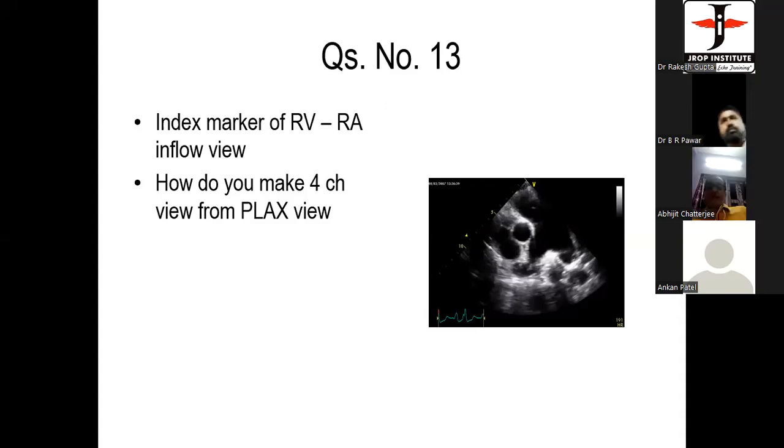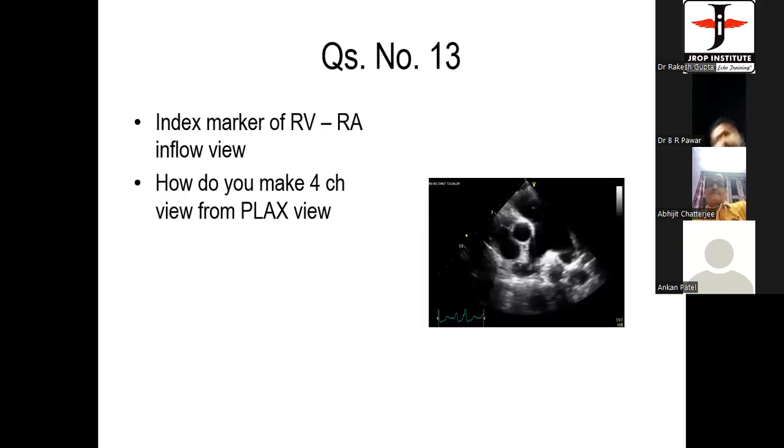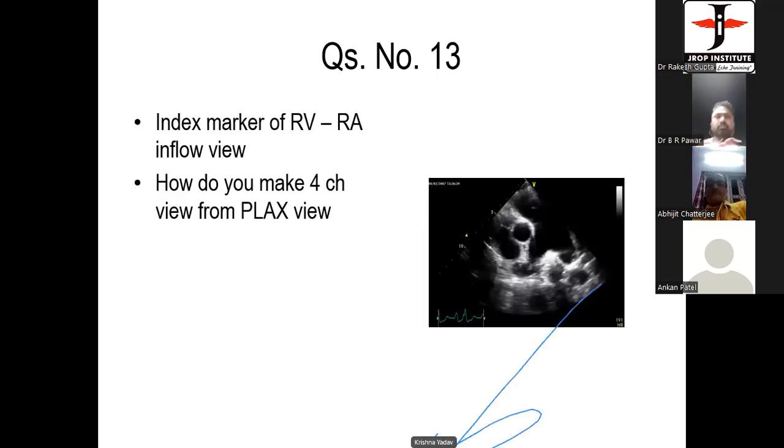Yes, sir. Can you see the aorta in the center of the picture? Yes, sir. By looking at the aorta from this view, can you tell whether the aortic valve is bicuspid or tricuspid? And how do you do that? Sir, it is a bicuspid valve, sir.